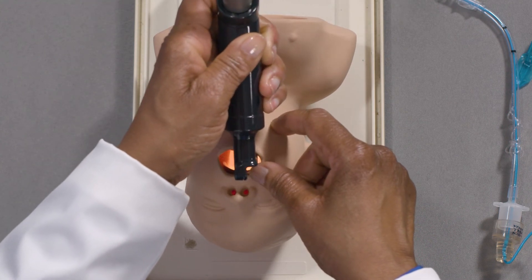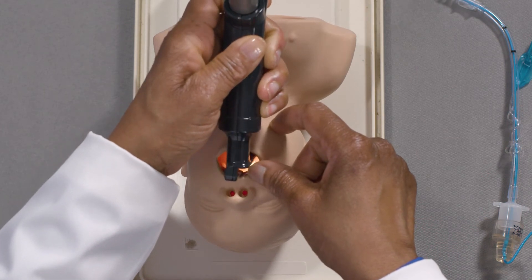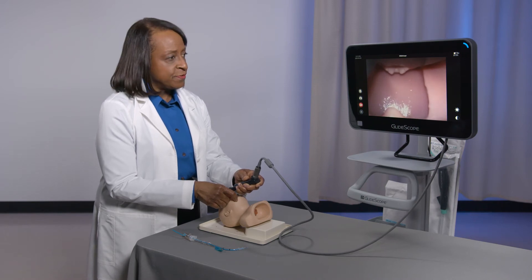Continue to look into the patient's mouth until the tip of the blade reaches the base of the tongue. At this point, you will transition your eyes to the video monitor.